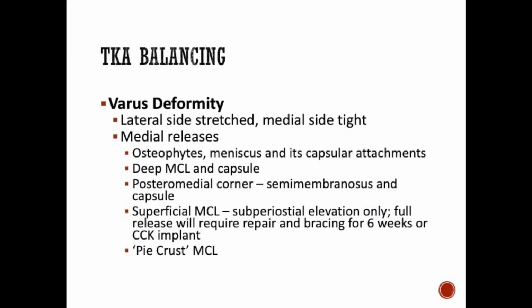Now, for balancing when it's not necessarily a gap problem so much as you have the same problem throughout the arc. So you have a varus deformity where you're tight medially throughout the entire arc of motion. So it is balanced, meaning you have the same instability problems in flexion and extension, and maybe you're good laterally, but you're too tight medially.